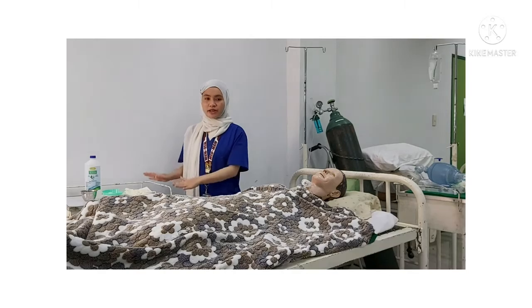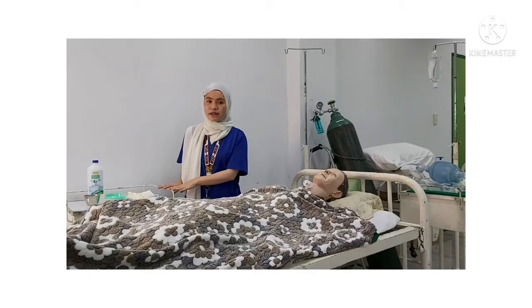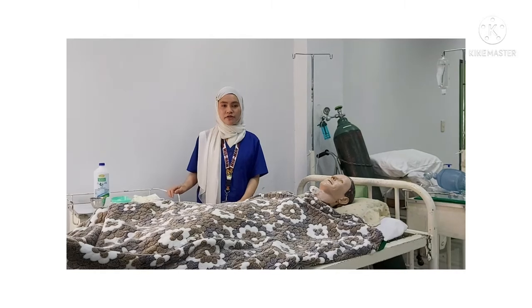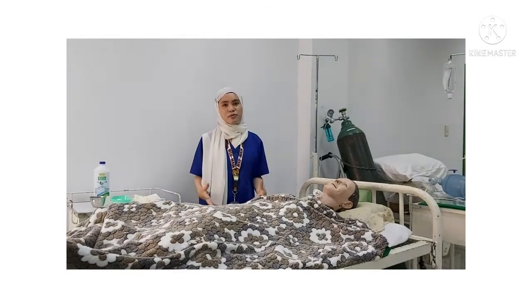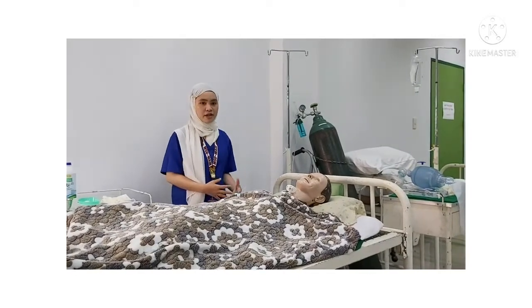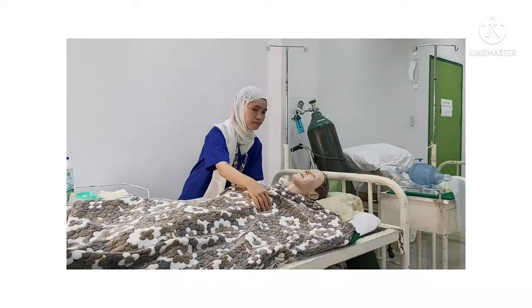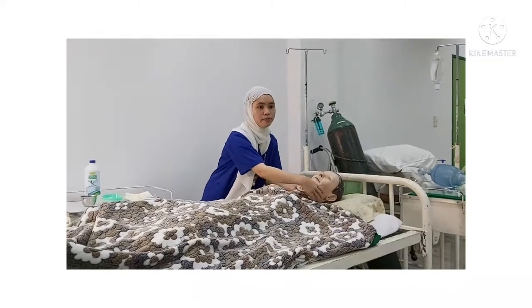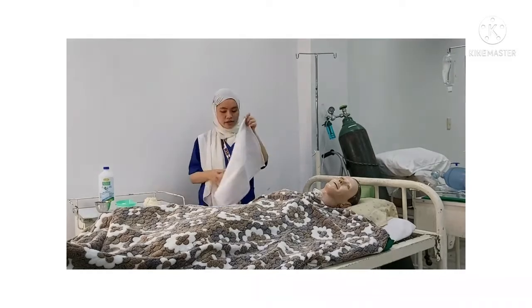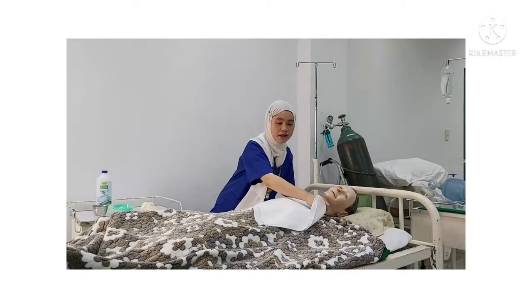Next is to prepare the necessary equipment, note the time, and turn the suction device on. Now wash hands. Supposedly I have already washed my hands. Now place the patient in a semi-Fowler's position to facilitate the insertion of the catheter. Now place a towel over the patient's chest. This is to absorb any leaking fluids.